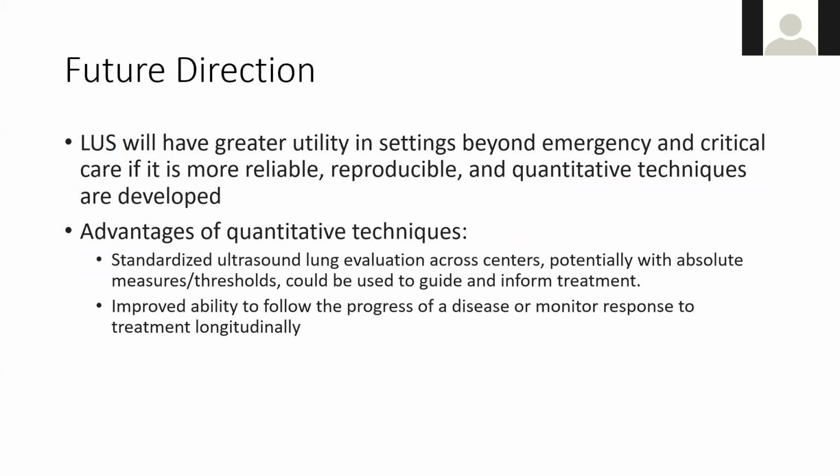Certainly, I think lung ultrasound will have even more utility outside of emergency and critical care if we can ensure it's reliable, reproducible, and if ultimately quantitative techniques are developed. And with development of quantitative techniques, some of the advantages may be that we can standardize lung evaluation across centers, which can be used to guide and inform treatment, and hopefully also improve our ability to follow the progress of a disease or monitor response.